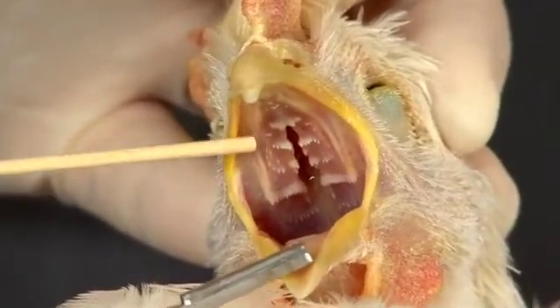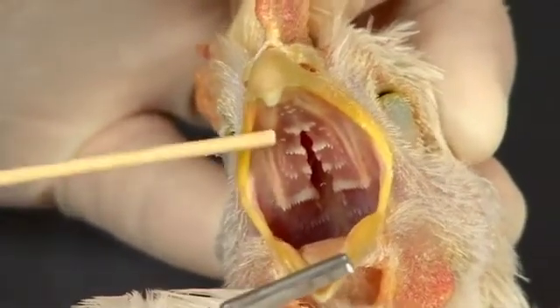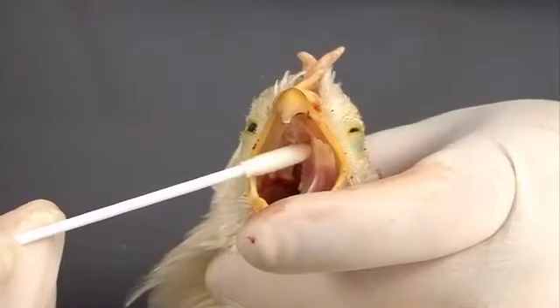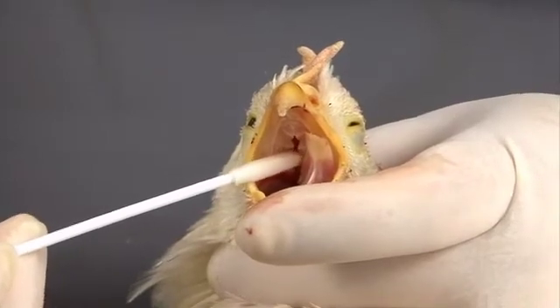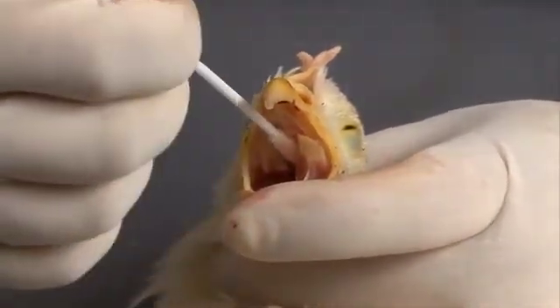The choana is also a good place to find respiratory exudate. Birds do not form liquid pus, and inspissated exudate tends to accumulate in the choanal orifice. If exudate is present, you can collect a swab sample from the choana or trachea at this time.